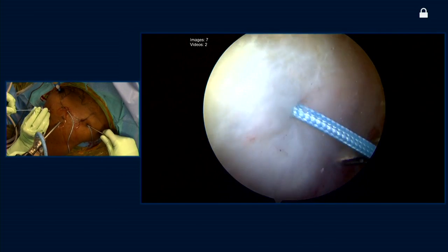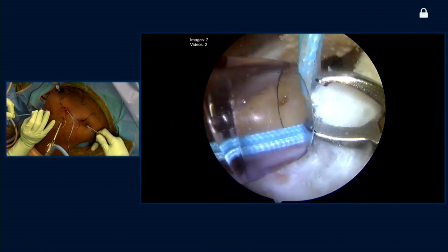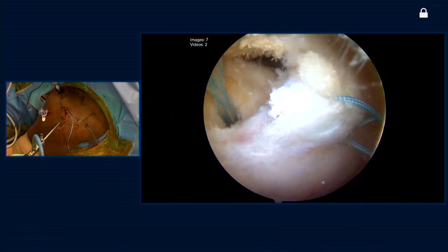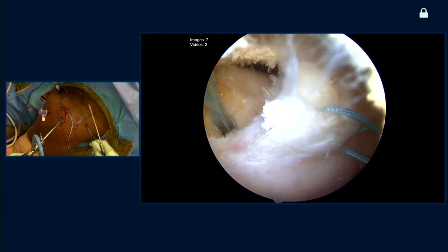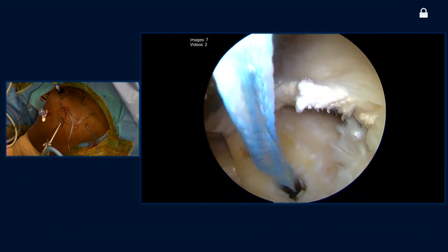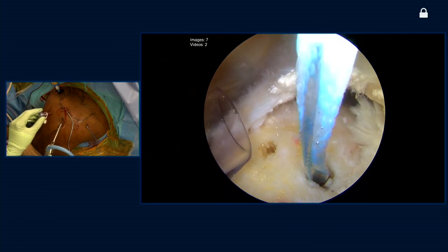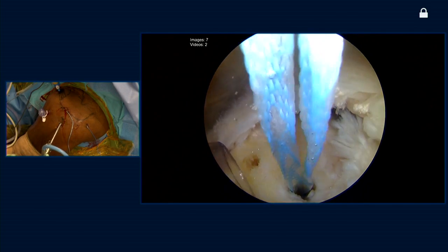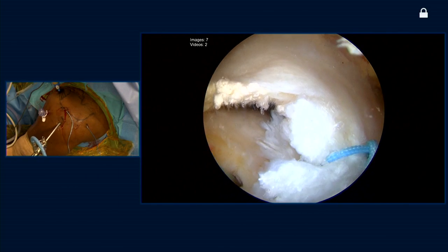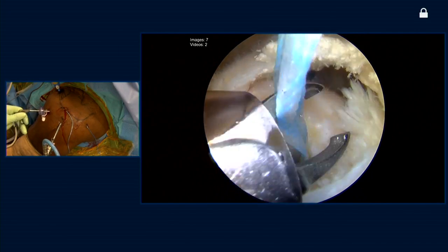There are lots of different ways to pass these sutures — is this your favorite way? I like to do this because my preference is to look from laterally. I think that helps me to appreciate the configuration of the tear — to identify the anatomy in terms of whether it goes from front to back or back to front. Certainly I could use a direct suture passing device from my lateral portal, but I find that the spectrum or an ACUPAS device is the most low profile and allows me to really choose my point of entry and penetrate the tissue exactly where I want while looking from a lateral portal.